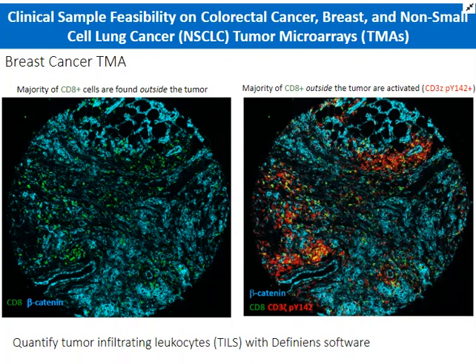When we add beta-catenin, we add another dimension of analysis because we can actually see where our CD8 positive T cells are in respect to the tumor. In this particular biopsy, a majority of these CD8 cells are actually found outside of the tumor. When you add our CD3-zeta 142 marker, you can see that most of these CD8 cells outside of the tumor are activated. We take these images and quantify how many CD8 cells are inside or outside of the tumor and how many are activated using the Definiens Architect software.